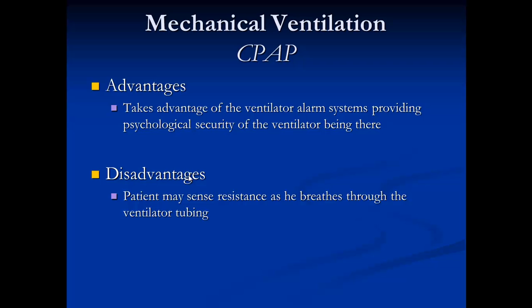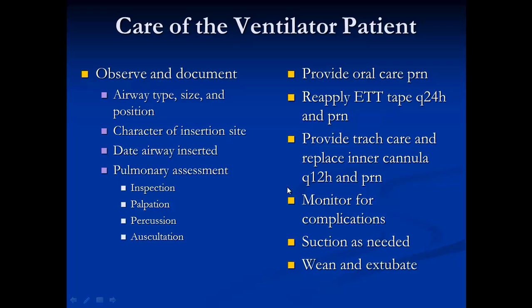Patients may sense resistance because they're completely awake. They're aware that they're intubated, so it's very, very hard to breathe through that tiny tube. It doesn't matter which size you choose. So patients describe that they feel like they're under the sea, breathing through a straw. So that's how difficult it is.